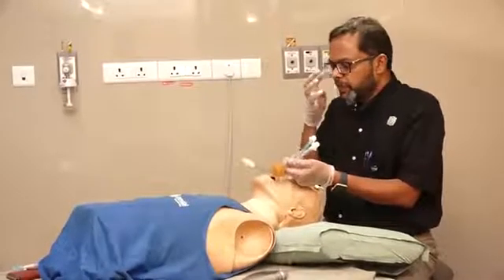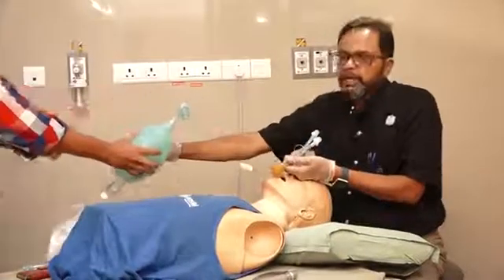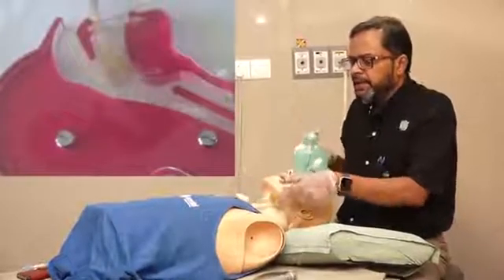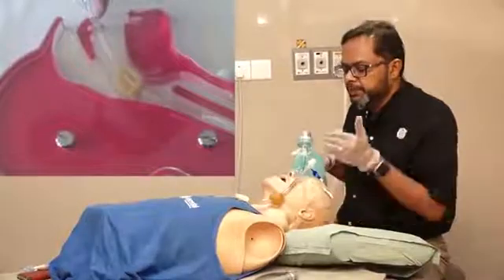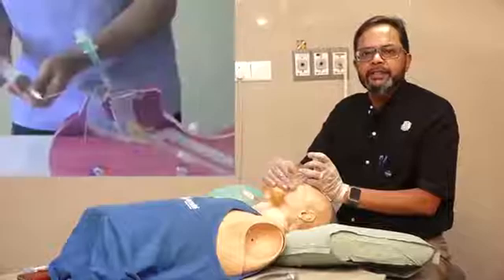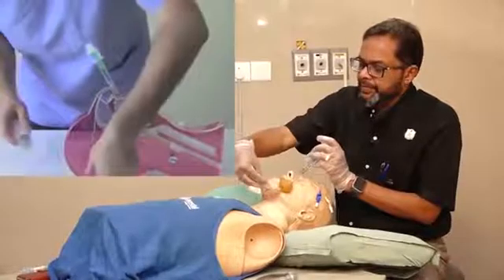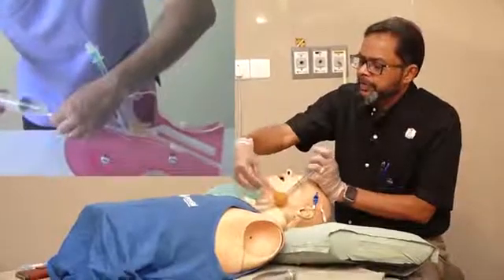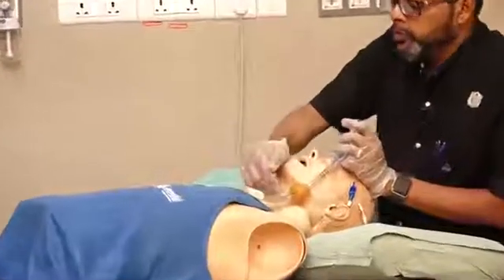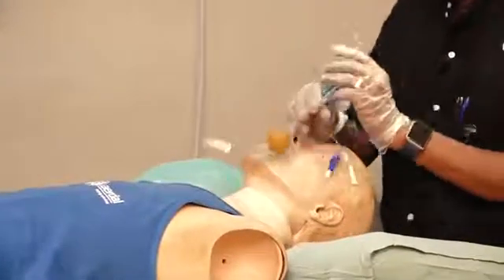For ventilation, start by attaching your ambu bag to tube number one and ventilate. If you get a chest rise, it means the tube is in the esophagus. Because the cuffs are sealing and the tube is in the esophagus, air leaks out through the four holes and gets into the airway and lungs.